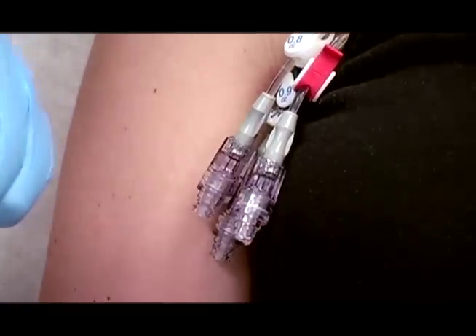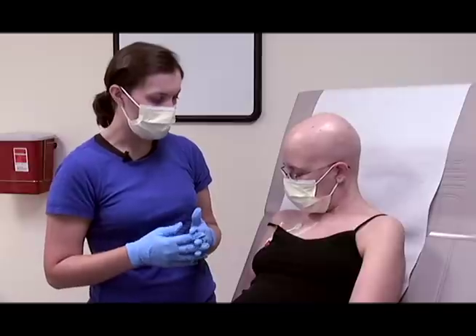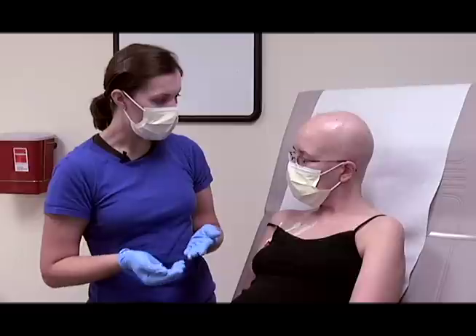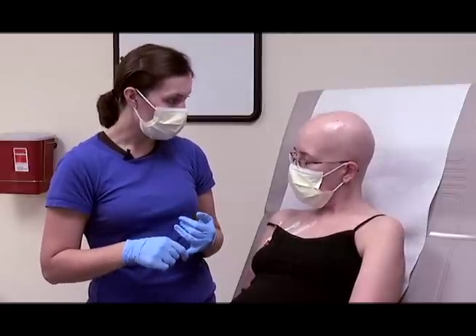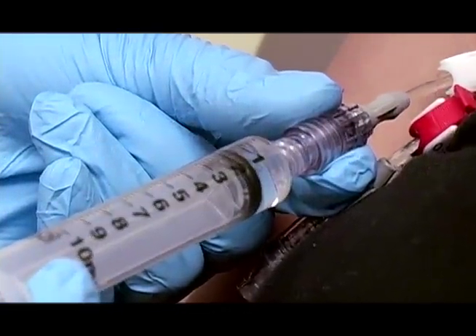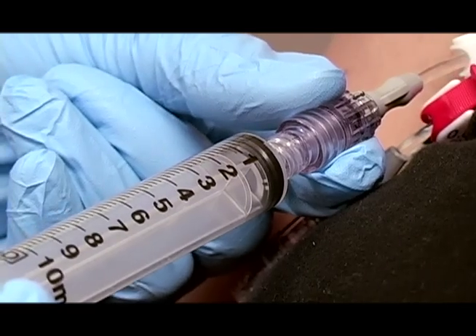Once the syringe is removed, repeat this process for each additional line in your catheter. Each time you flush, you should feel similar sensations and encounter similar resistance. There may be some variation, but it is important to notice any big changes. Some patients report having a sweet or bitter aroma or taste. Some patients feel a cool sensation as the fluids travel through the line.